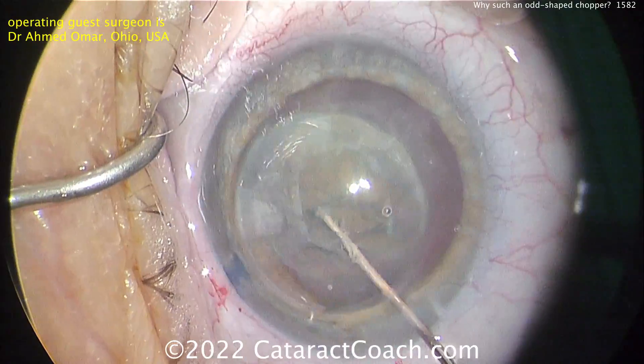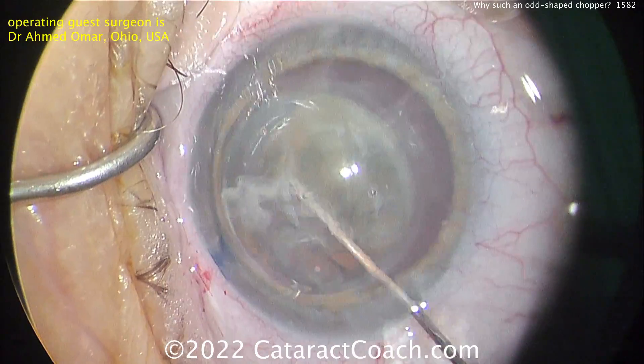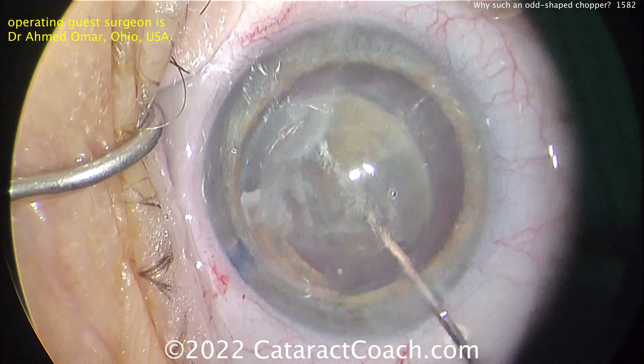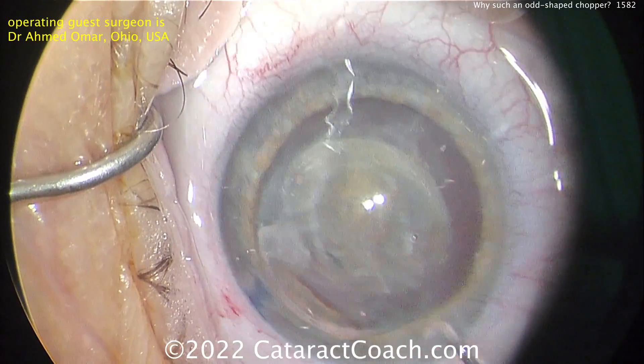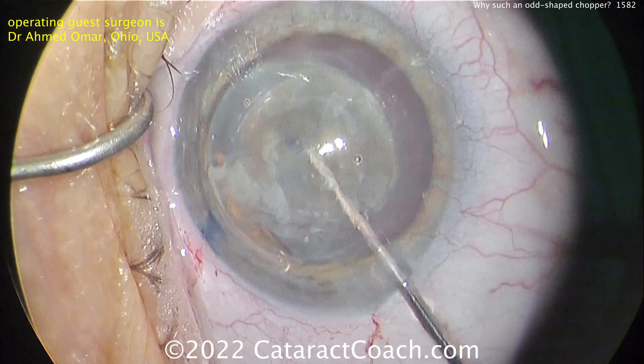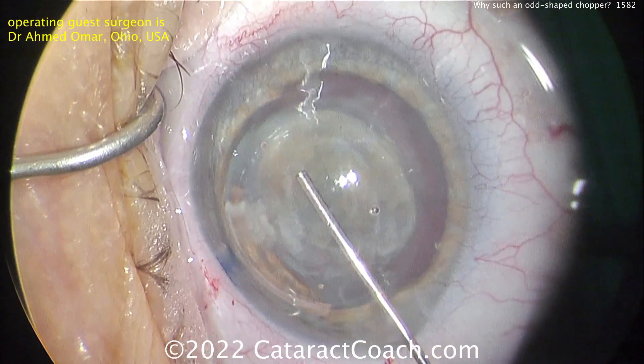The peripheral cornea is a little bit distorted, and that's okay. But what that means is, as the instruments go inside the eye, they're going to appear distorted, because you're looking through the cornea too. In the central cornea, where you're going to operate and do the nucleus removal, it's going to look just fine. But the catch is going to be there in the peripheral cornea.